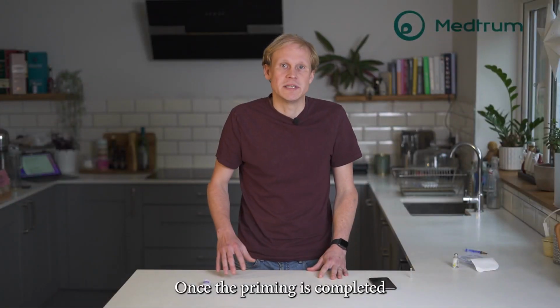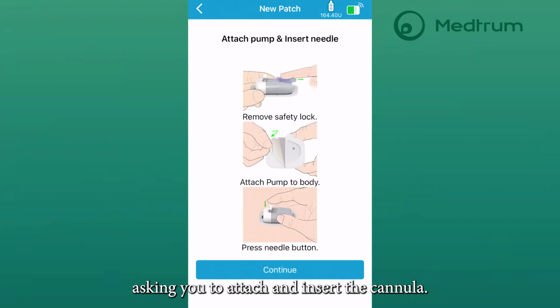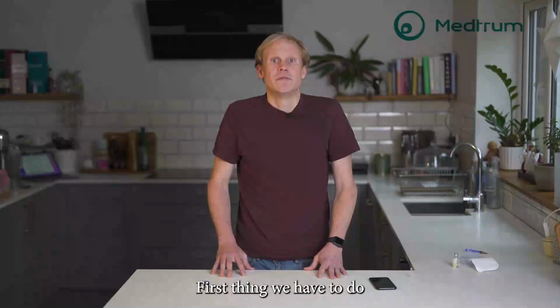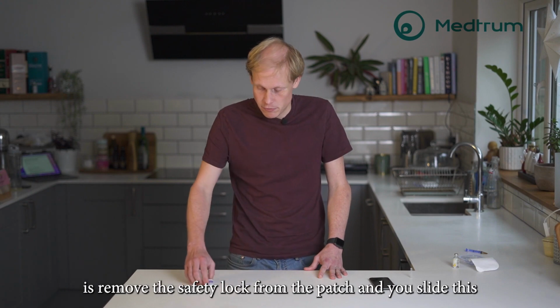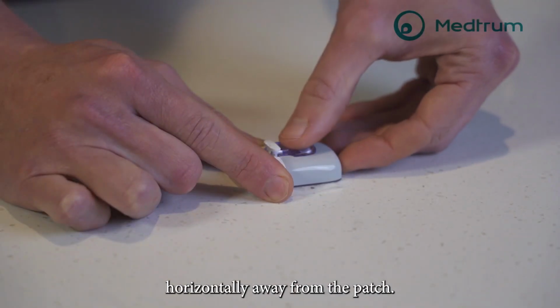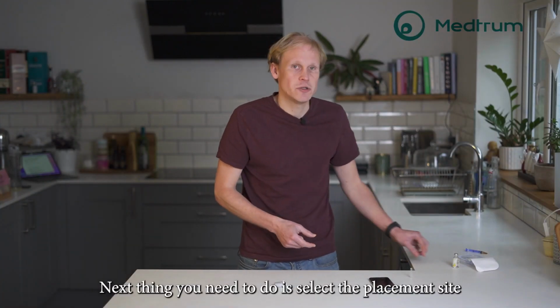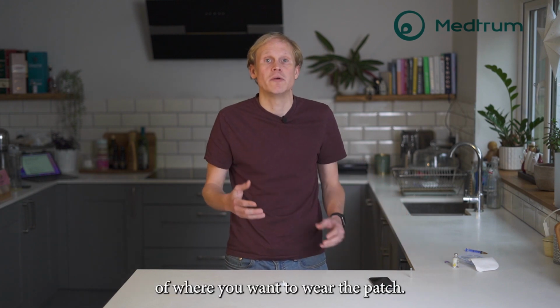Once the priming has completed, you'll get a screen on the mobile phone asking you to attach and insert the cannula. First thing we have to do is remove the safety lock from the patch, and you slide this horizontally away from the patch. Next thing you need to do is select the placement site of where you want to wear the patch.